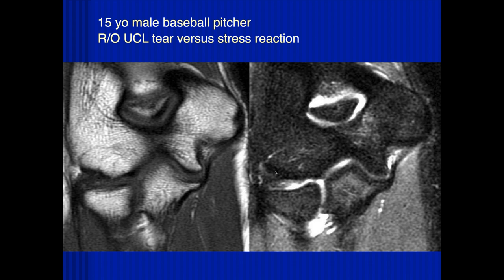15-year-old male, baseball pitcher — ulnar collateral ligament tear versus stress reaction. The anterior band of the ulnar collateral ligament looks grossly intact. There's a little bit of increased signal on the inner aspect of those fibers, so maybe it's like a partial tear. It looks like there are still some fibers attaching to the humerus. I'm worried about that fat signal — that kind of triangle you're outlining. That's a normal fat pad. If you don't see it, that's abnormal.